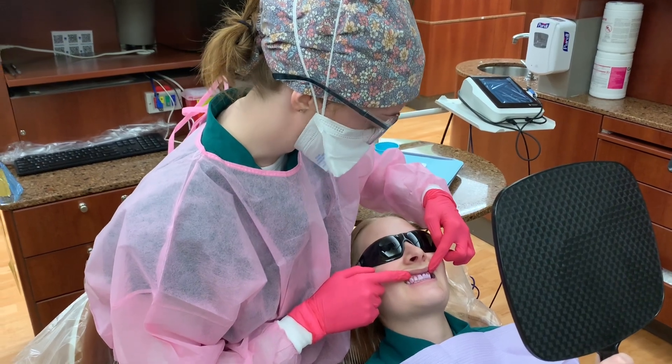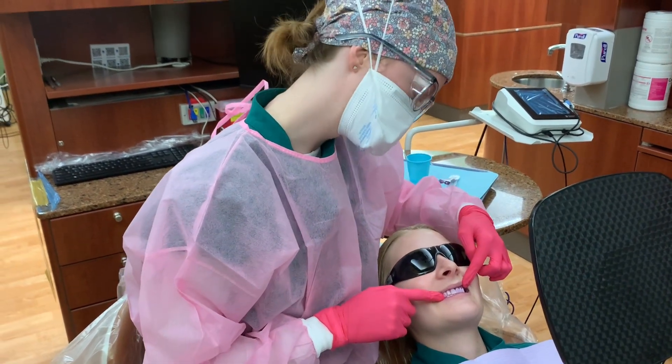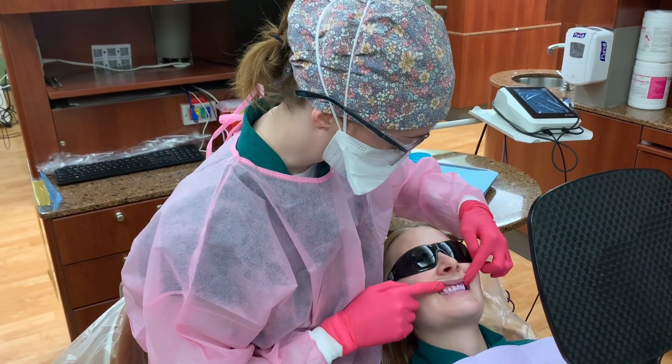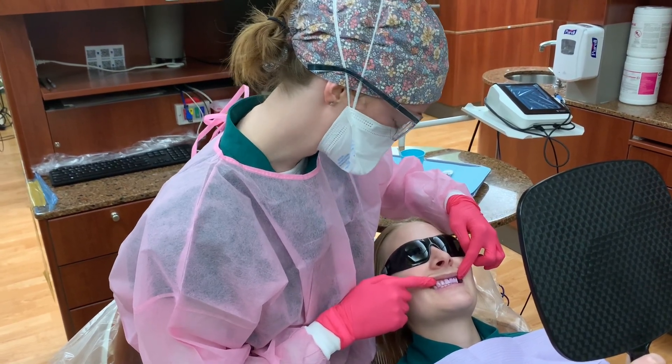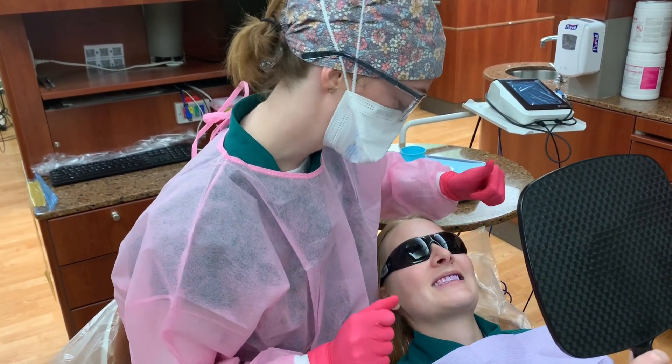The first thing we're going to talk about is this pink color that you can see here. The pink color represents plaque that's been there less than 24 hours. It hasn't solidified, so it's easy to remove with a toothbrush.